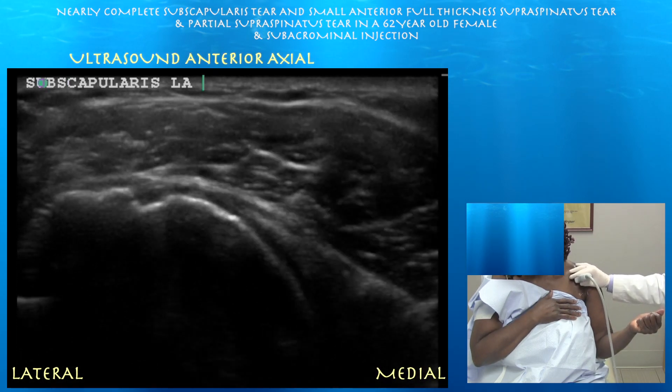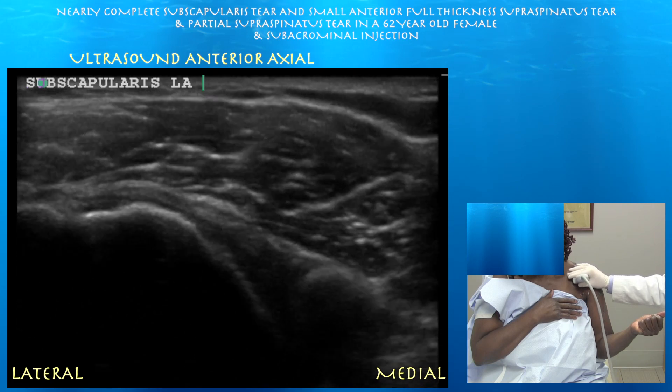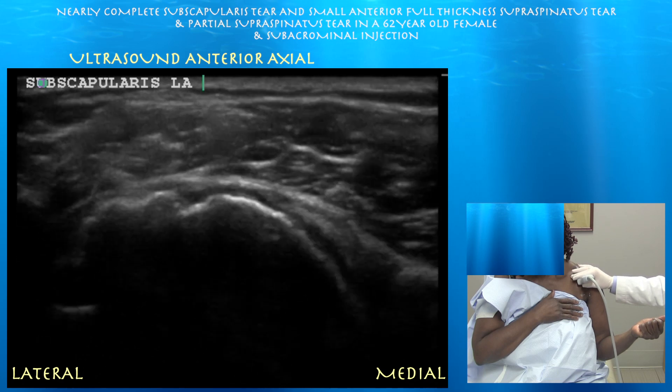Here's the subscapularis in the long axis. You really don't see much of a tendon. You can see essentially the deltoid muscle going right down to the bone. There's this void where you would expect the subscapularis tendon. You can see the lesser tuberosity with essentially just nothing attached to it. Right side of the screen is medial. This is a pretty rare, full-thickness, just about complete tear of the subscapularis tendon.